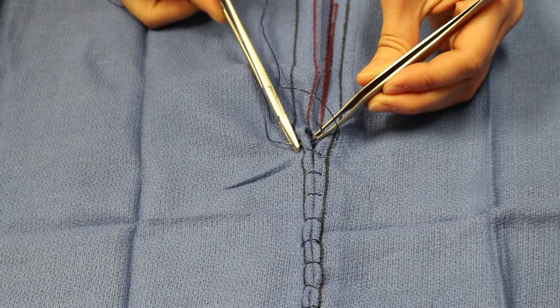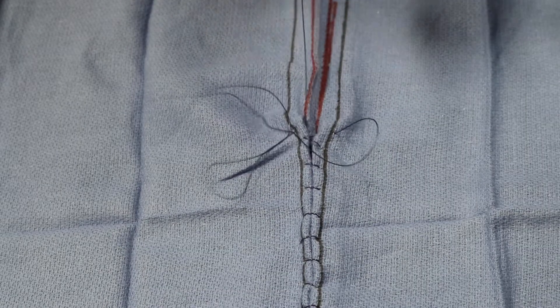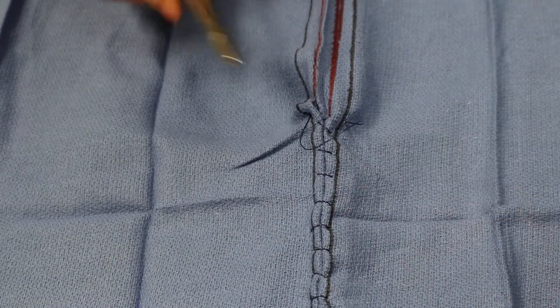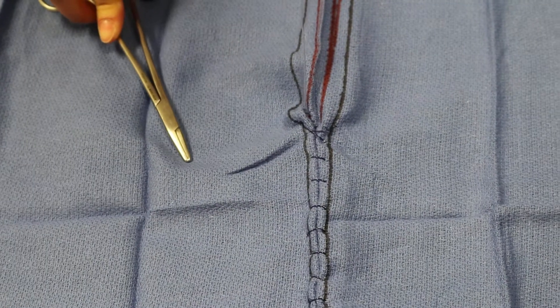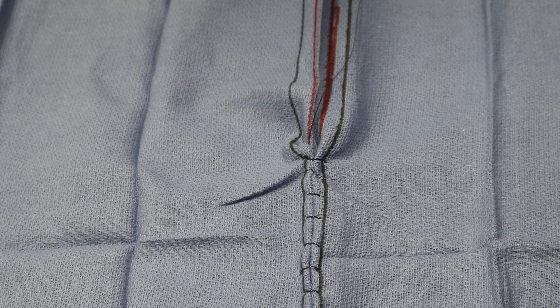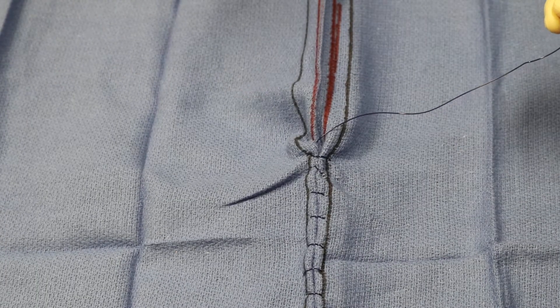So that's a superficial to deep bite. That can be pulled to get rid of the loop that you see and we're going to start our next loop. Sometimes when you're in surgery it helps to say 'I'm building a deep loop' so that everybody kind of knows what the plan is. Pull that tight and then hand that suture coming right out of the suture site to your assistant and say just hang on to this right here because this is my deep loop.